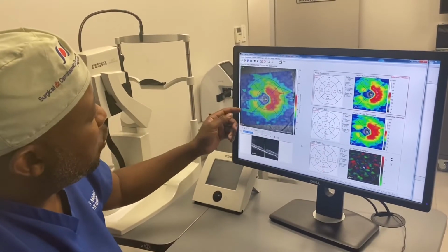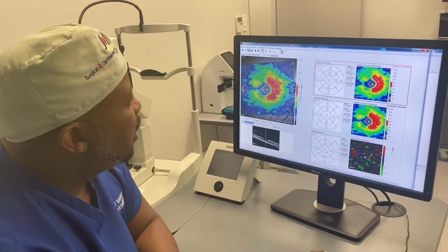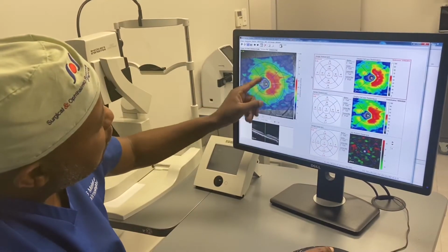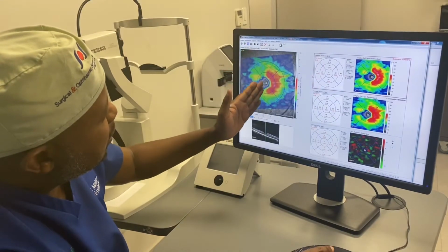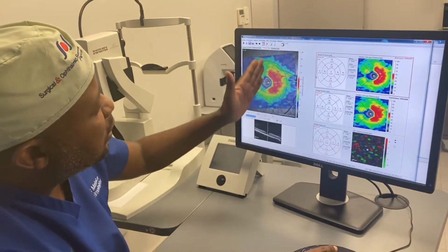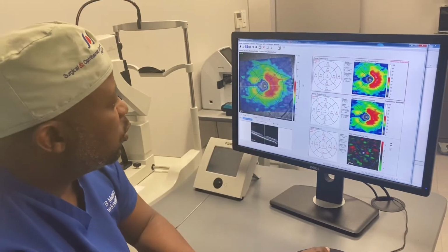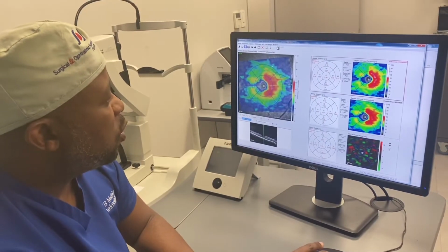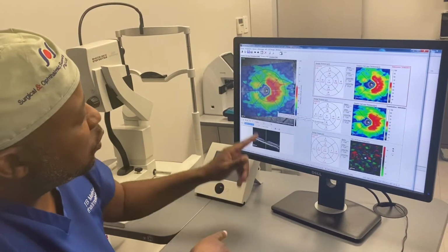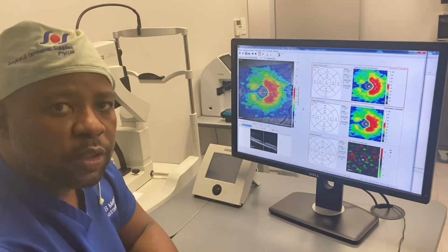In this patient, however, you can see that the donut is not complete, representing an abnormal ganglion cell population. And if you can just look at this, the loss of ganglion cells respects the vertical meridian, and this is quite abnormal, and this patient actually would be suspected of having a pituitary tumor that presses on the optic nerve, and you can actually send this patient for CT scan analysis to see if they have a pituitary tumor or not.